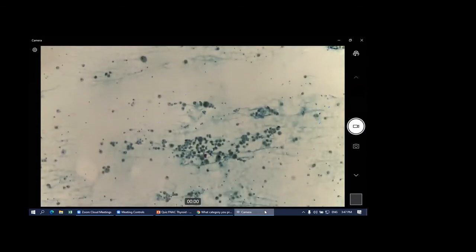this is done under ultrasound guidance. Okay, it is not that cellular. You cannot see that much colloid as well, but I guess all of you know what the majority of the cells are that we can see there. Okay, just focus a bit.